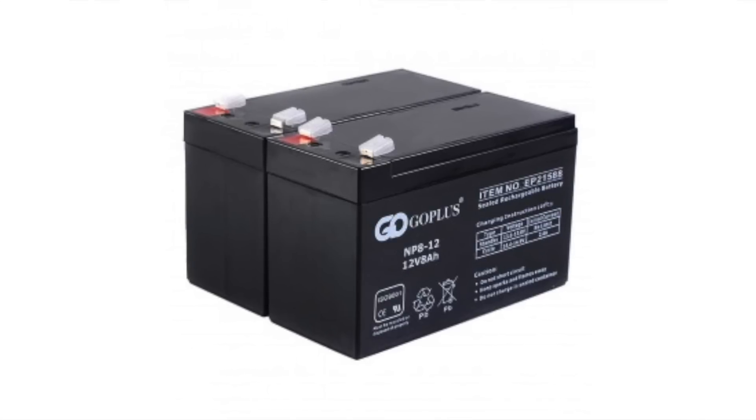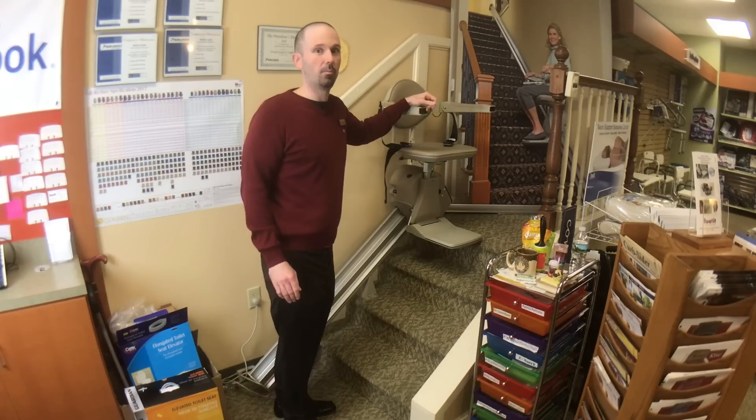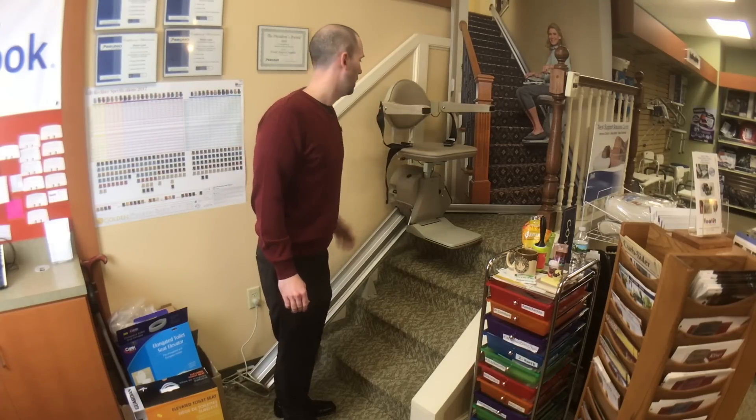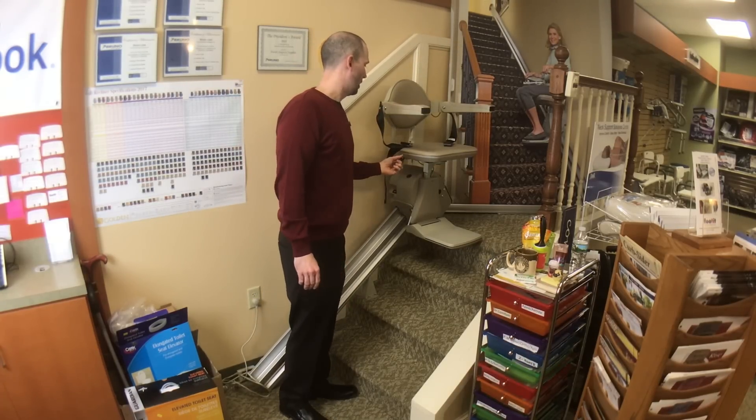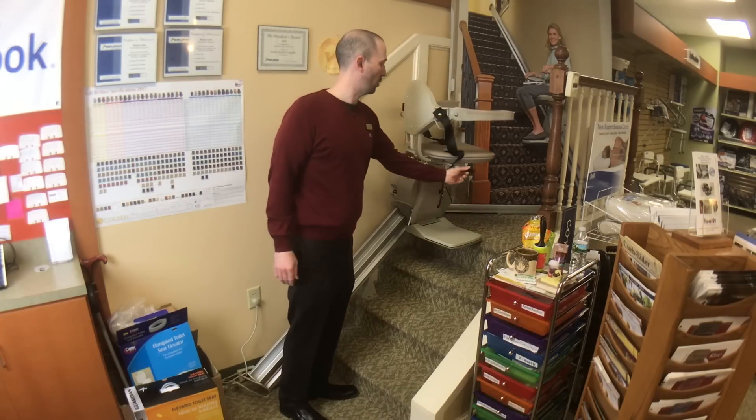It runs on two 12-volt batteries, which will give you about 10 trips up and down before a complete power failure. On the seat, you have two levers so you can swivel over.